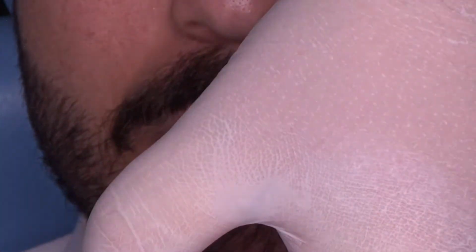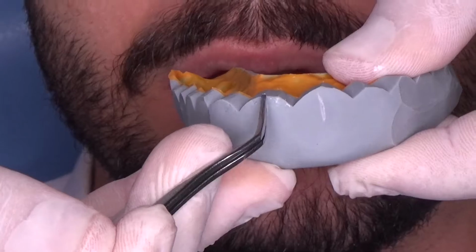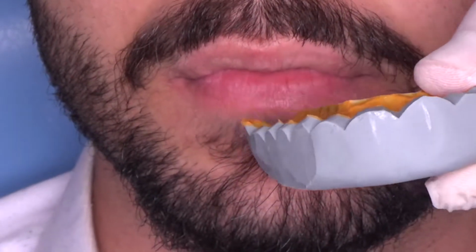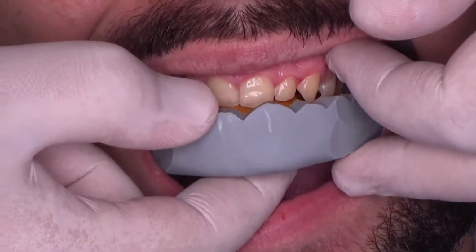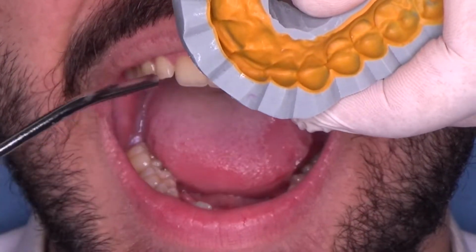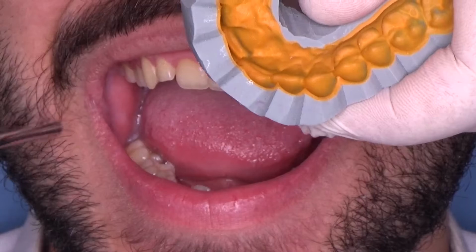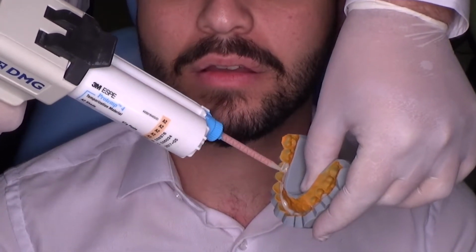Okay, thank you. It's good to mark where your central incisors are on the silicone, just with a pen or with your instrument, it doesn't matter, to know exactly how to position it. Otherwise, you can be lost and you will wonder where the position is. So you have to air dry a little bit. Our mock-up is from 1.5 to 2.5. You have to put a little bit of bisacrylic out of the mouth, place it vestibularly, and fill up the index from 5 to 5.